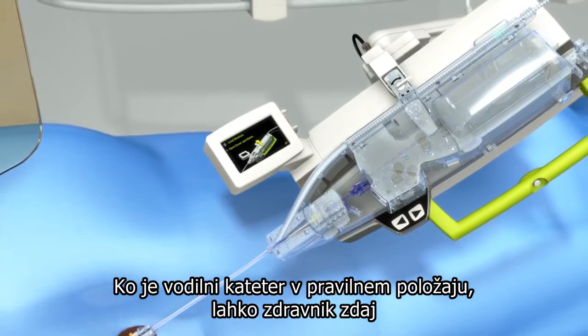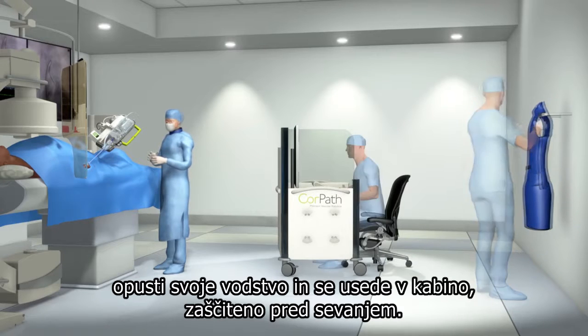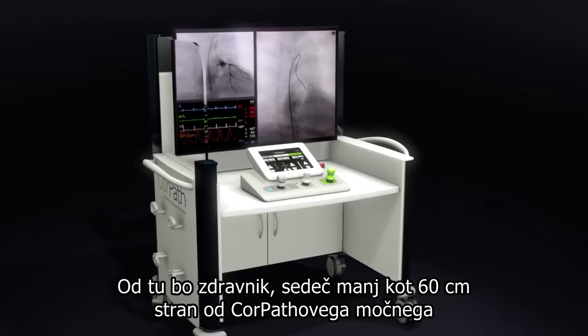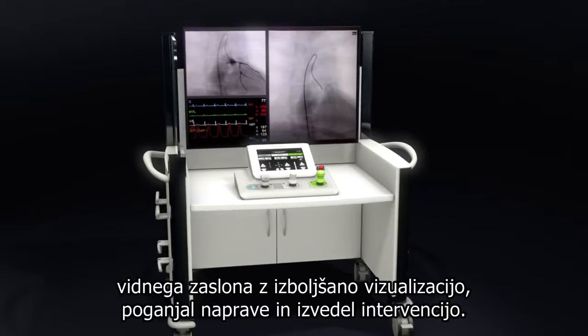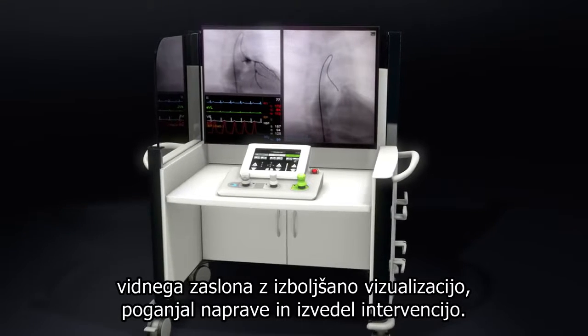Once the guide catheter is in position, the physician can now remove his lead and sit down within the radiation shielded cockpit. From here, sitting less than two feet away from the CorePath's power vision monitor with enhanced visualization, the physician will drive the devices and perform the intervention.